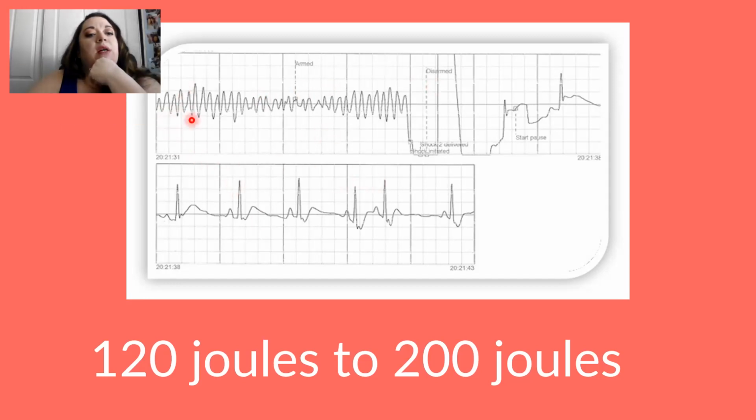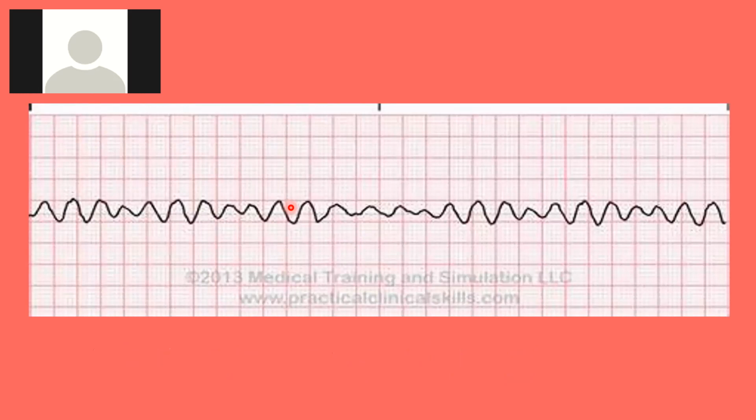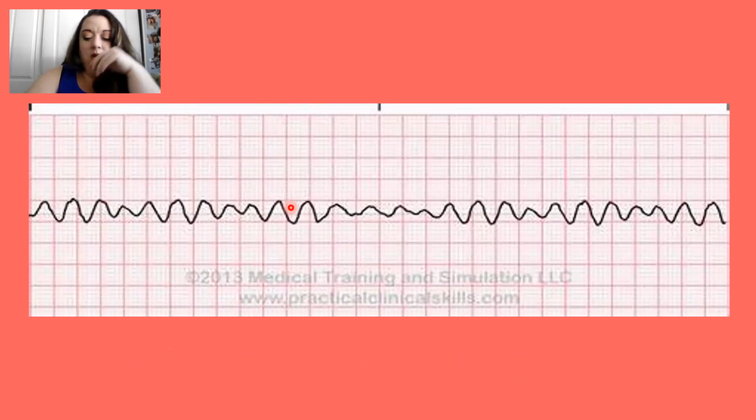All righty. So here I have actually what looks like torsades, huge discharge from my defibrillation, and then your heart starts to go into a normal rhythm here. What's this one? V-fib. Yeah. So can you shock this one? Yes. So there's your 2 shockable rhythms.